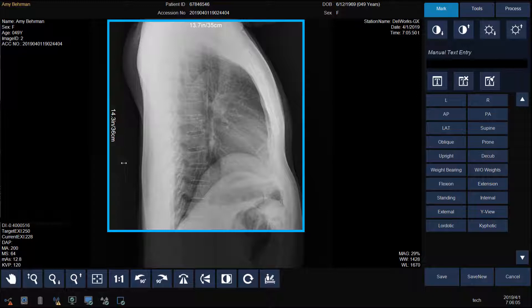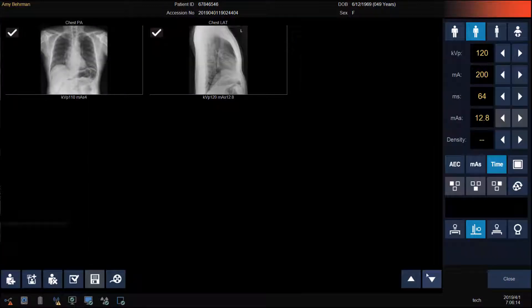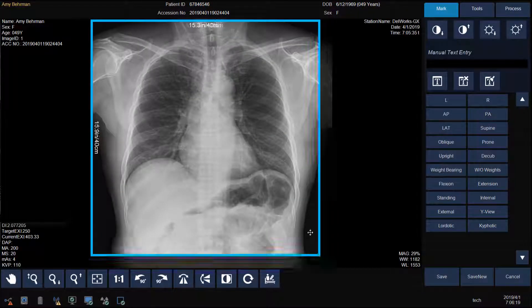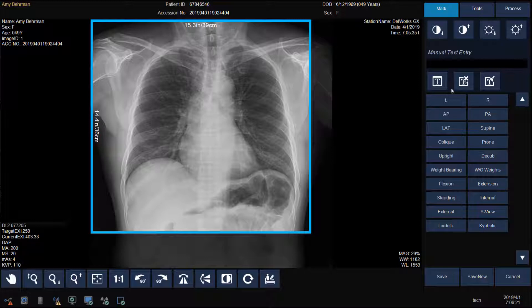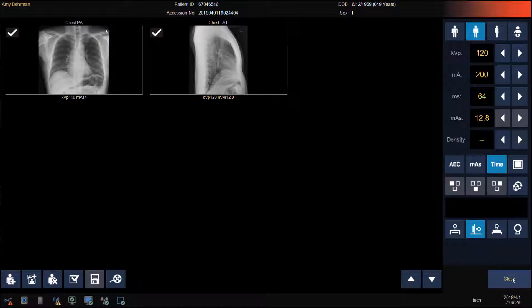To adjust the shutter, just drag the blue bar in. To add a marker, click on the marker and then position it on the image. Click Save. Click Close to send the images to PACS.